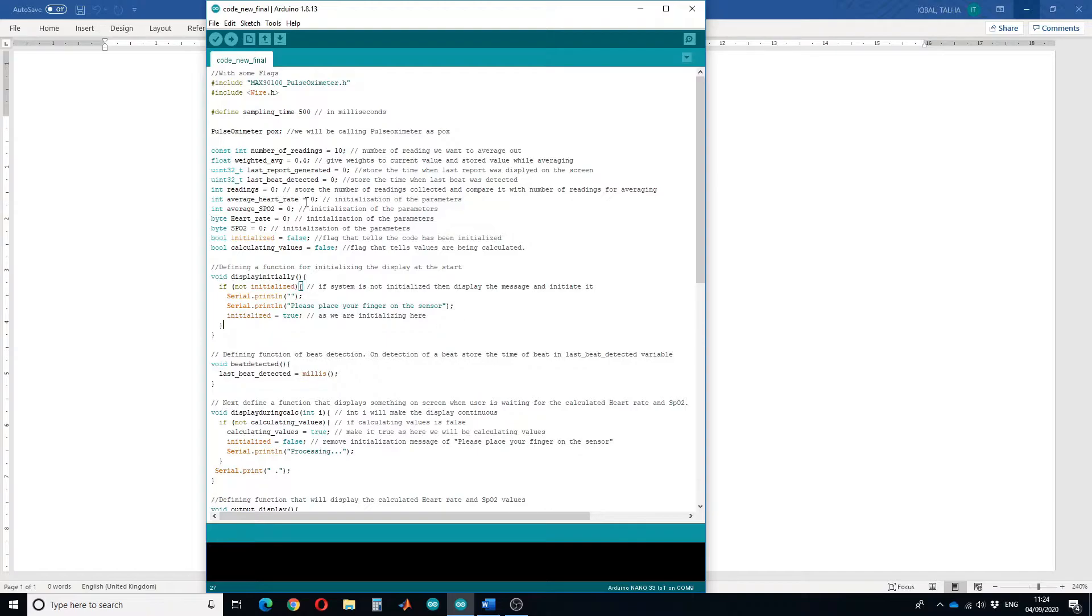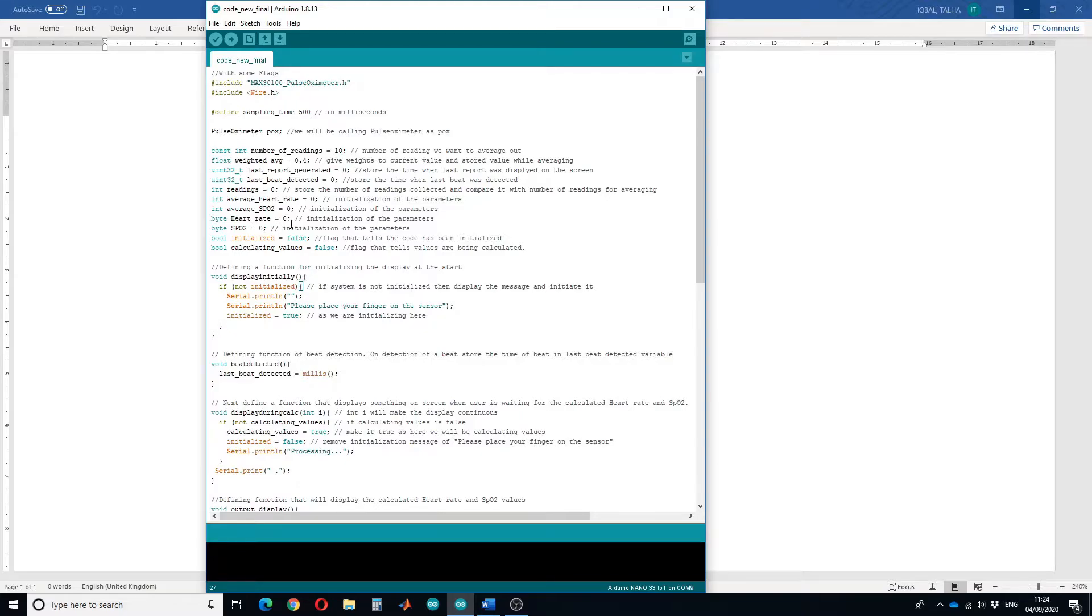Average heart rate will store the value of heart rate while average SPO2 will store the value of oxygen saturation. Heart rate and SPO2 are initialized with zero as we do not want any garbage value at the start.